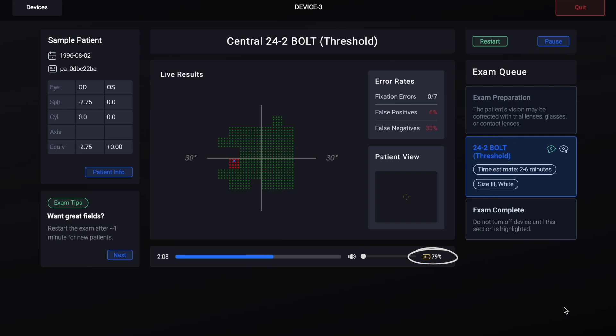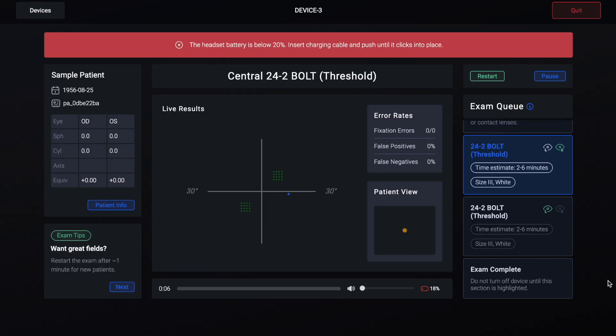The battery status for your device is shown on the progress page while the exam is running. It is important to keep the headset charged above 20 percent at all times so that it does not run out of battery during an exam. If the headset is below 20 percent, an alert will display on the progress page to notify you that the device should be plugged in.